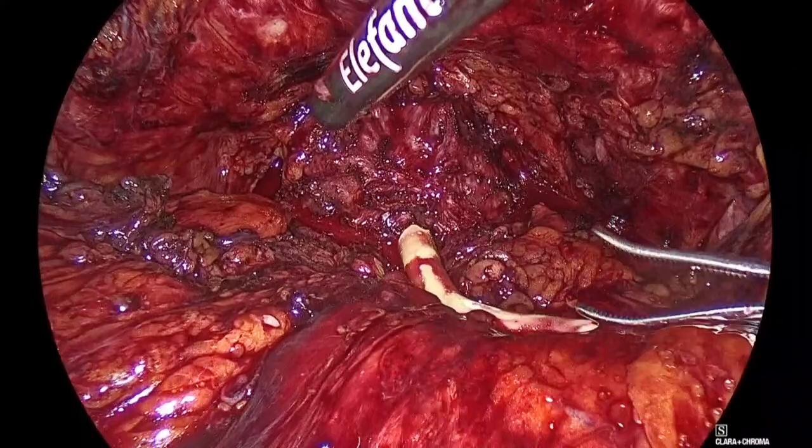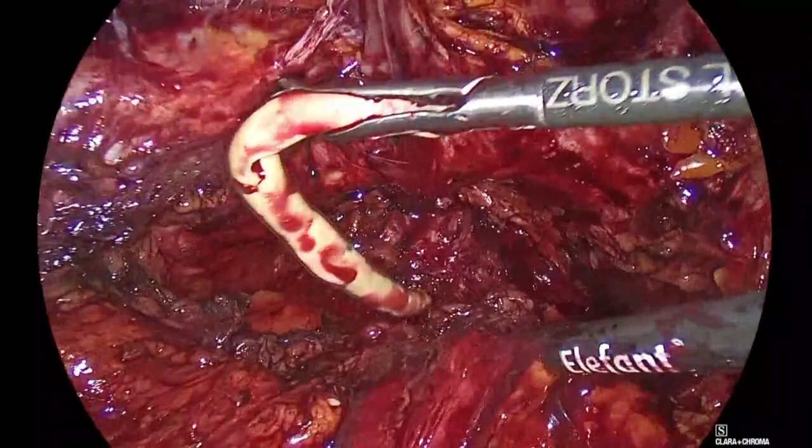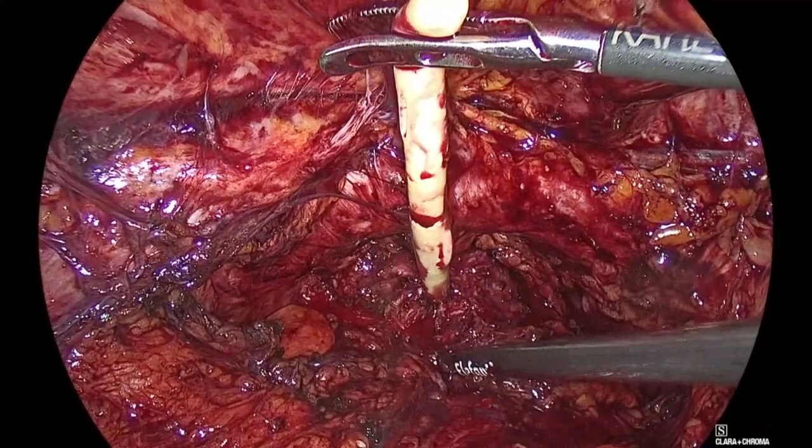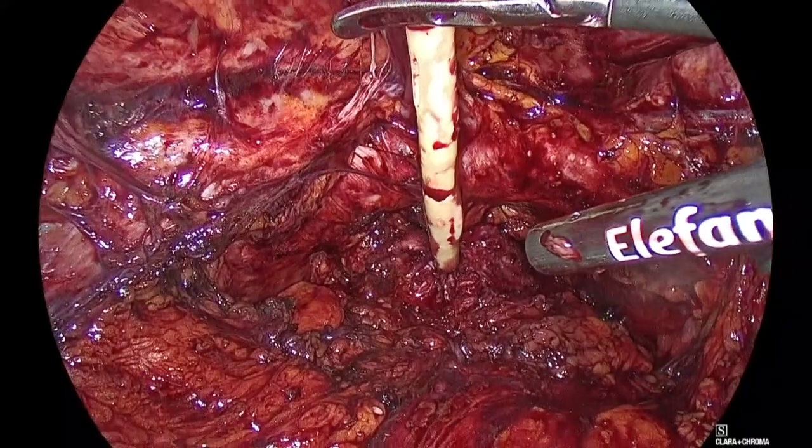Give me a grasper. No, grasper, laparoscopy. Good, okay. Stay up, Panagioti. Give me a gauze. Stay up on the bone, Panagioti. So now we want to just make sure that we get some traction here. Good. Okay. No, harmonic. Okay.